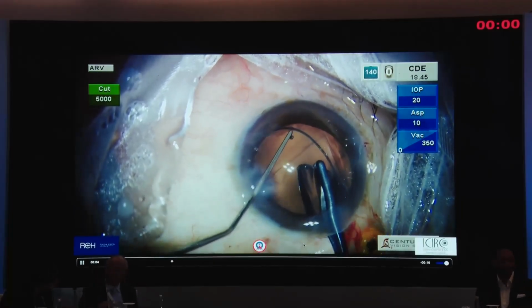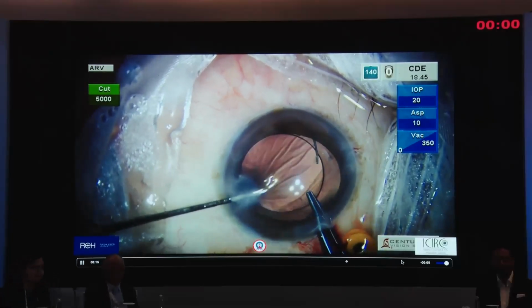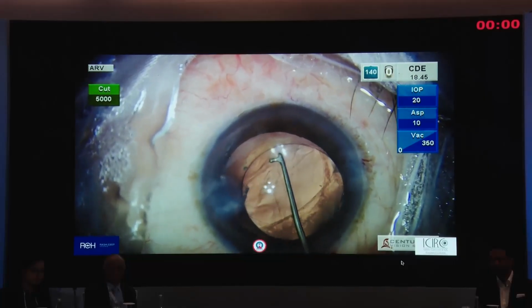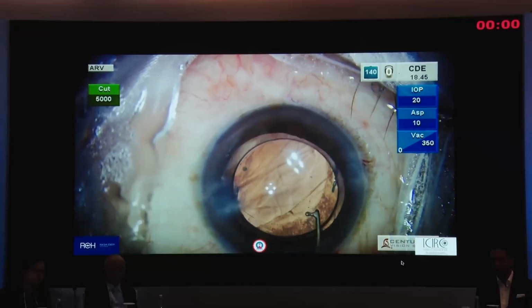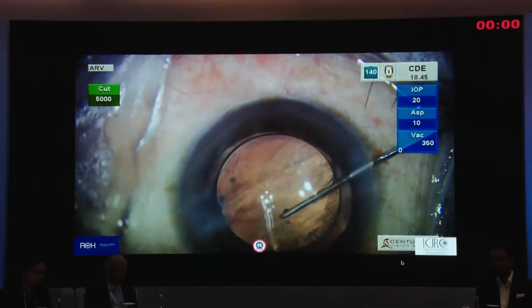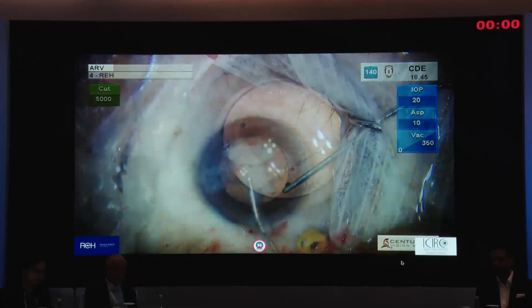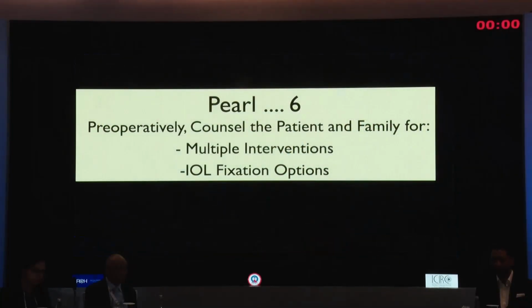And once again, the procedure is repeated, where we put the lens haptic in the ciliary sulcus and capture through the tear as well as the anterior capsule. Because these tears have been present for some time, they are fairly strong, so you don't need to worry about it. I'm just trying to show that the optic is behind the tear as well as the anterior capsule, and then always check it, as I showed you in the early part, and make sure.